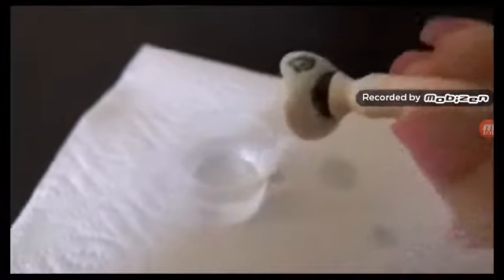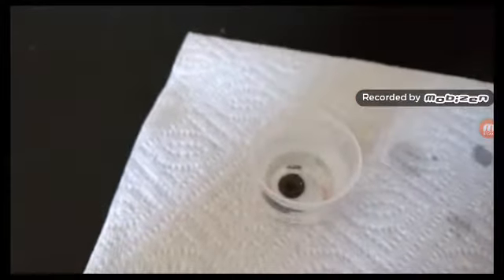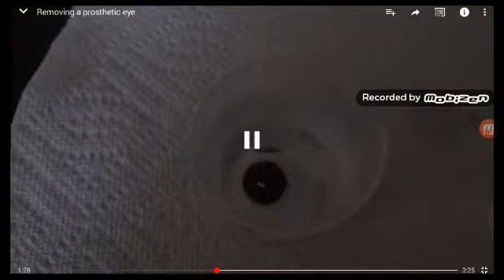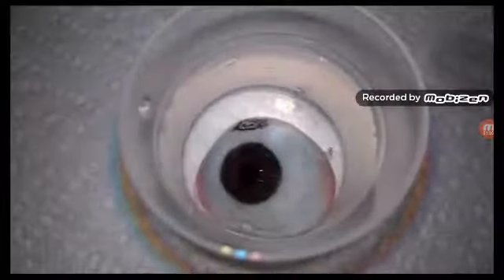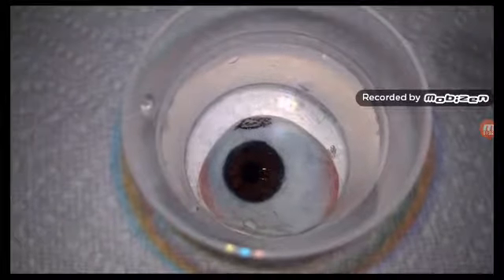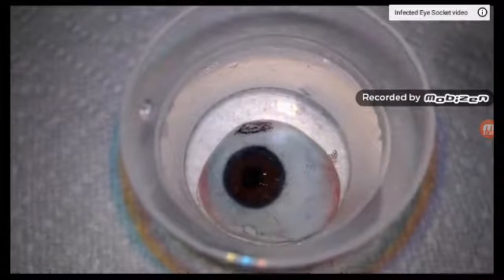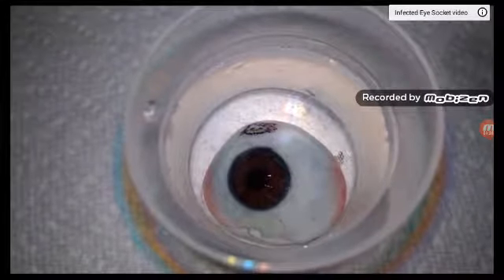I'm going to take the prosthetic eye. We are going to soak it in hydrogen peroxide — I like to do it for at least 15 minutes. You can see Giselle's eye is still soaking. You can see all the little bubbles are forming. That lets us know that it's getting nice and clean.